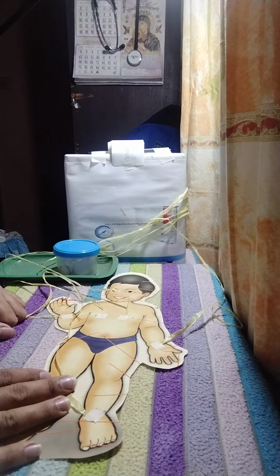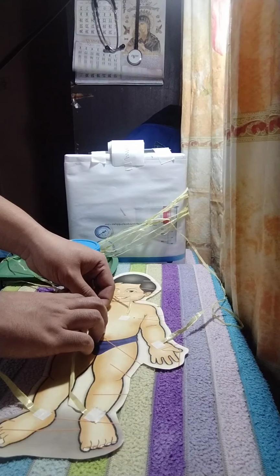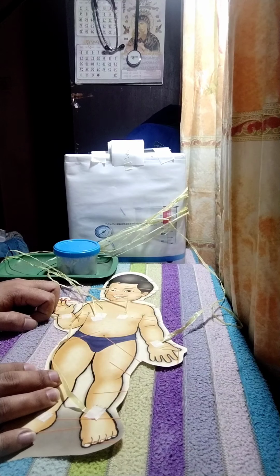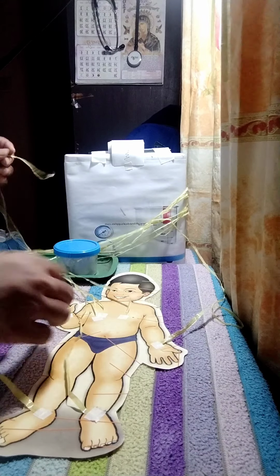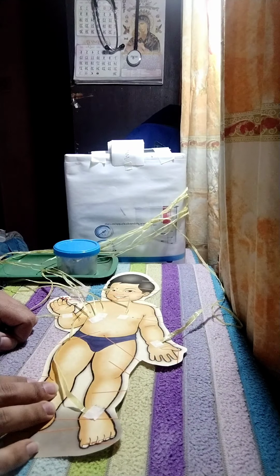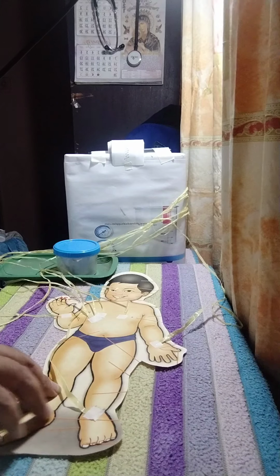V3, halfway between V2 and V4. V4, fifth intercostal space at the left midclavicular line. V5, fifth intercostal space at the anterior axillary line, halfway between V4 and V6.